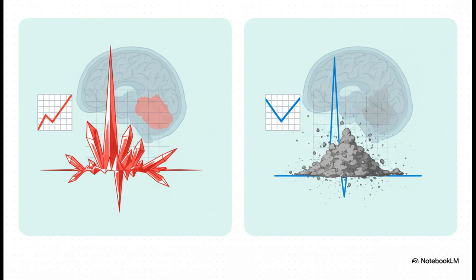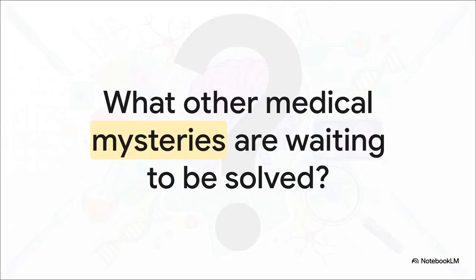We bring in our high-tech tool, magnetic resonance spectroscopy, or MRS. It basically does a chemical analysis of the tissue without ever having to touch it. If it sees high levels of a chemical called choline, which is a marker for new cells being made, that means something is growing. The tumor's back. But if it sees high levels of lipids and lactate, which are markers of cell death, that's just a scar. The mantra is super easy to remember. More choline, more problems. And there you have it.